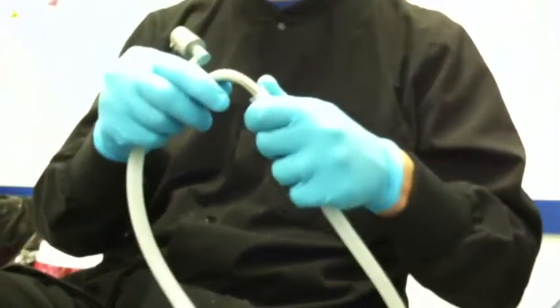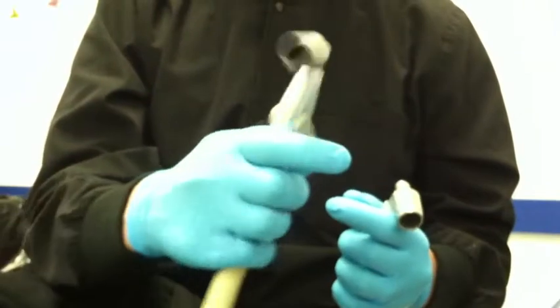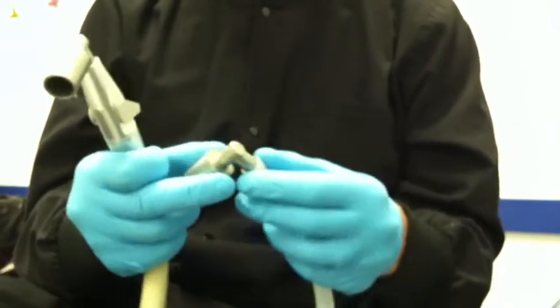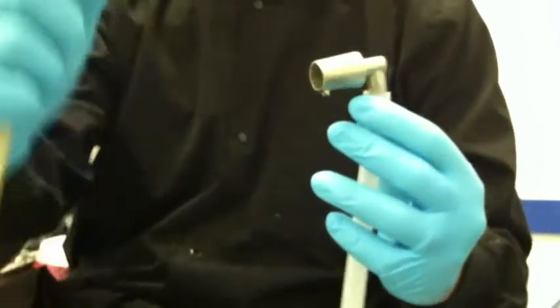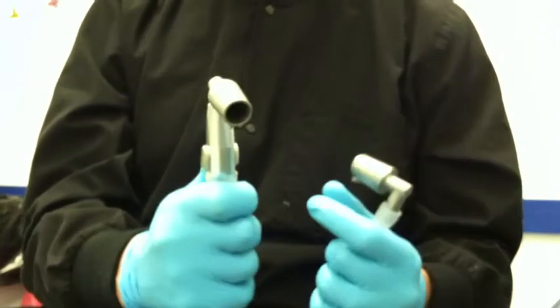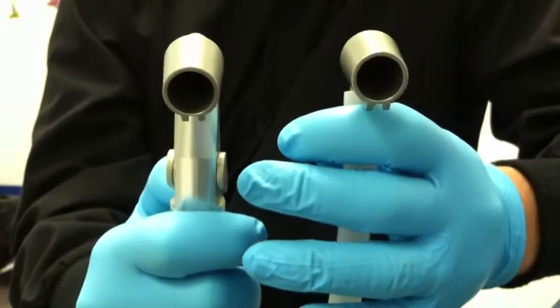I'm just going to compare it so you can see the difference in volume. I've got two HVE valves right here. I'm going to put the first one in. I have the Kona adapter attached to the HVE valve directly, which works fine. But some people were asking about having something like this, so that's why I decided to make it.